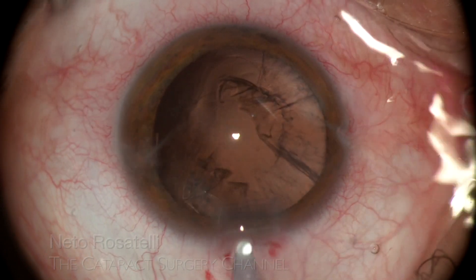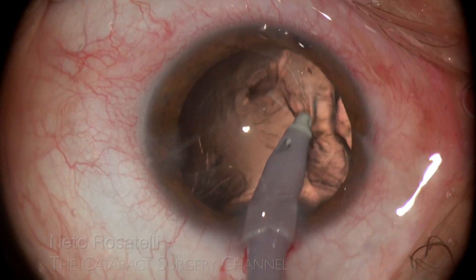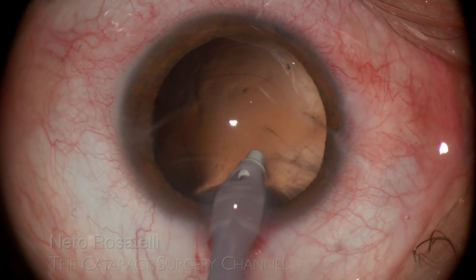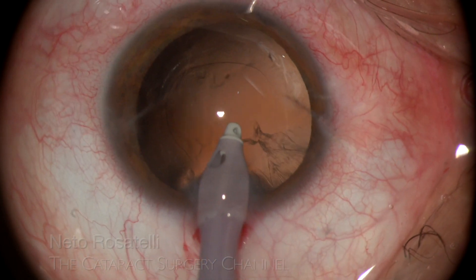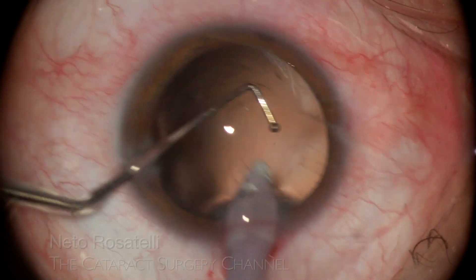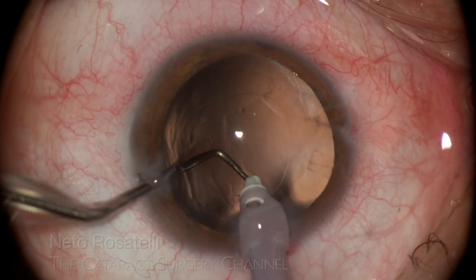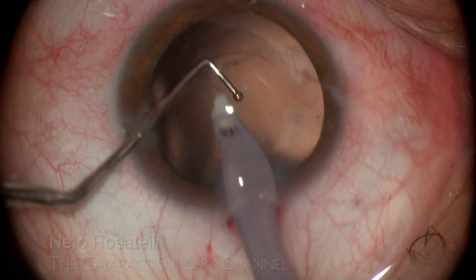Coaxial IA with a polymer tip is chosen to do the cortex aspiration. In these cases with zonular defects, irrigating fluid can pass through Berger's space, causing a kind of collapsed bag, offering difficulty in cortex clean-up. Chopper assistance holding the posterior capsule down helps in subincisional cortex aspiration — a maneuver I often do in this situation. Luckily, the cortex easily detaches from the capsule, probably due to the previous maneuvers done.